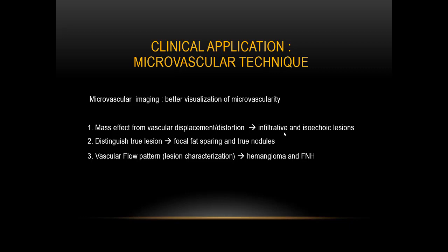This represents something happening inside the liver or the organ that we are studying, either infiltrative, especially a lesion that is isoechoic that we cannot see on B mode. If there is mass effect from vascular displacement, this confirms a true lesion.